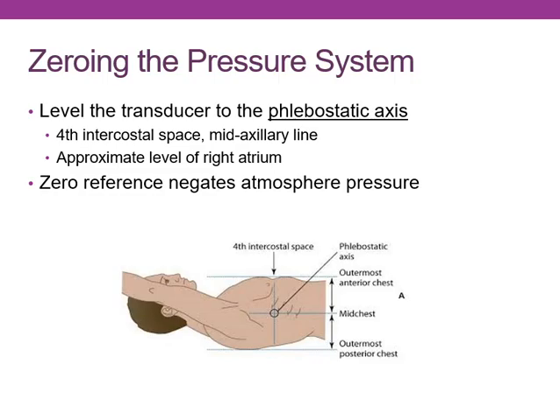All right, so let's talk about zeroing the system and why we zero. The reason we zero is I need an accurate pressure of the patient.